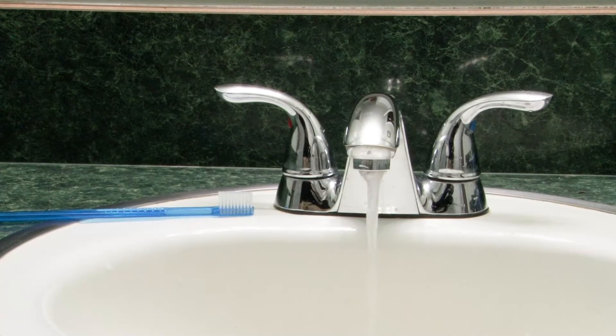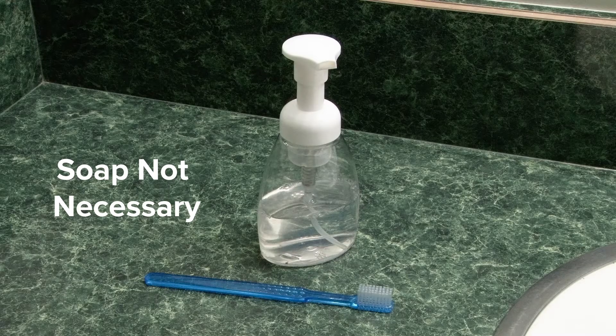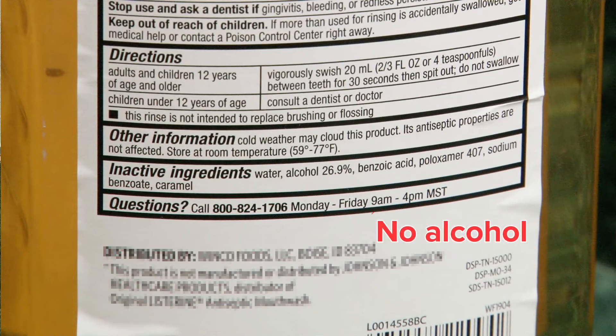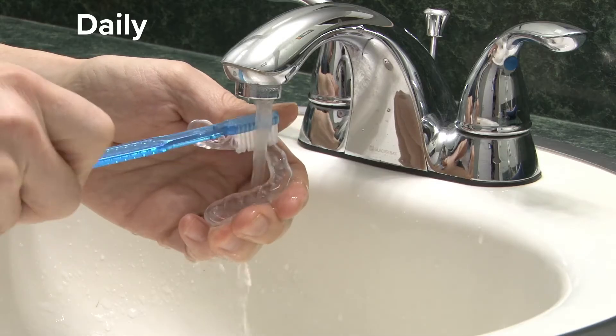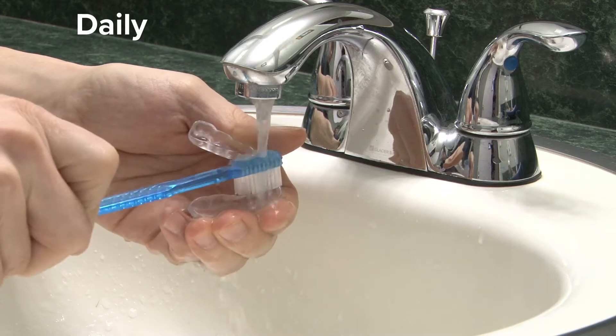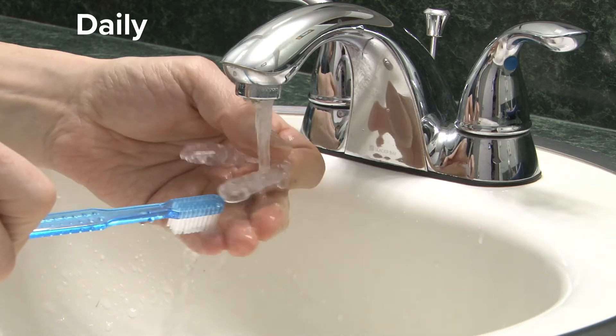For the daily quick clean, you really only need a toothbrush and some cold water. Additionally, you can use some non-abrasive soap, but that typically isn't necessary if you follow the recommended cleaning schedule. What's important is that you don't use any alcohol-based mouthwash when cleaning your night guard. You'll want to make sure you brush the entire surface on both sides — this includes the side that fits over your teeth, as well as the smooth side.